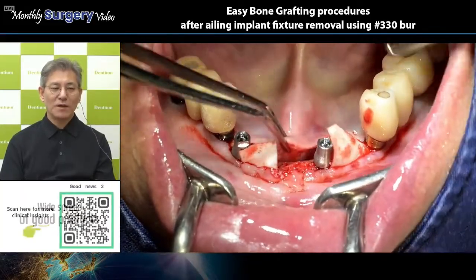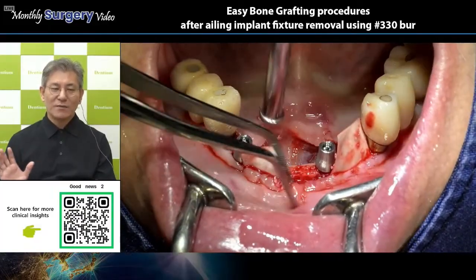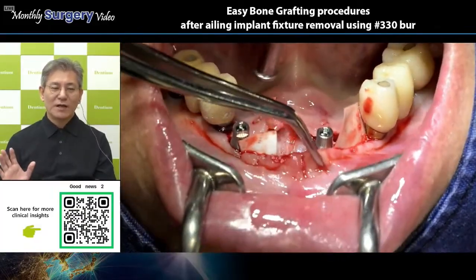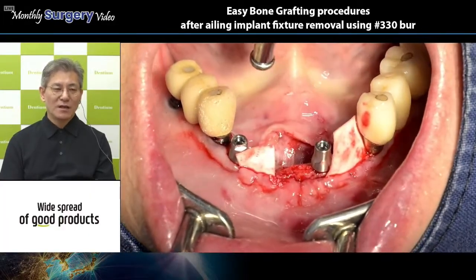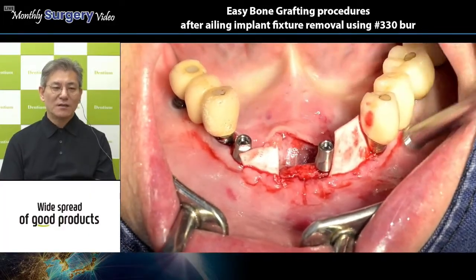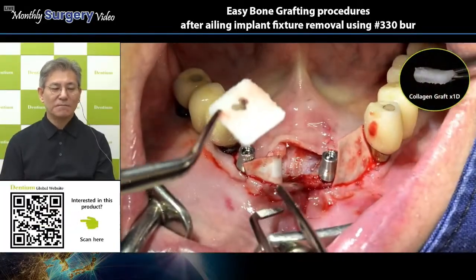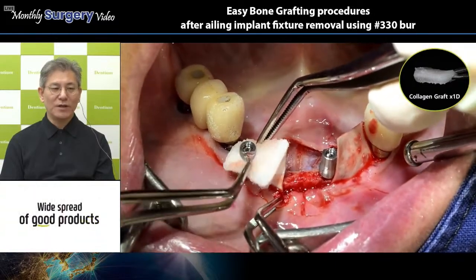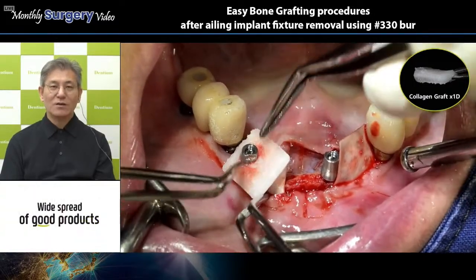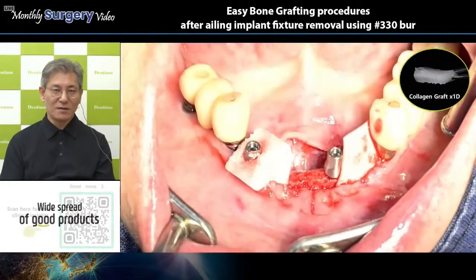The stiff buccal flap is holding the collagen bone in the buccal area, and the stability is enough with this stiff flap and the tugging between the flap and bone area, in the case of a three-wall defect, a contained defect like this, right?